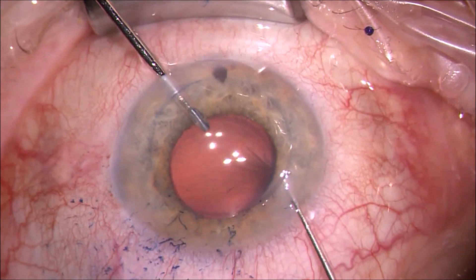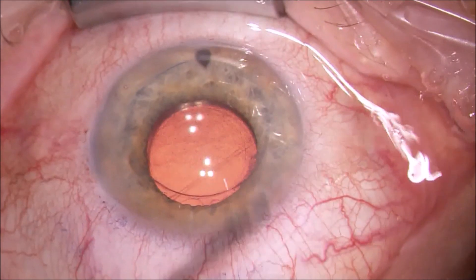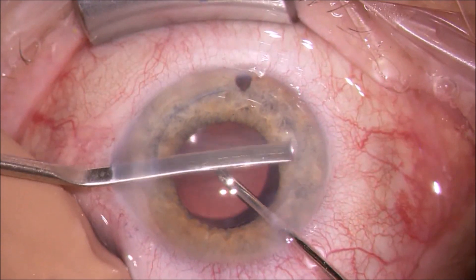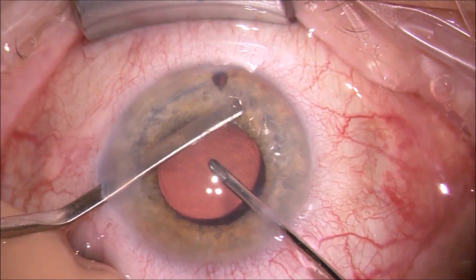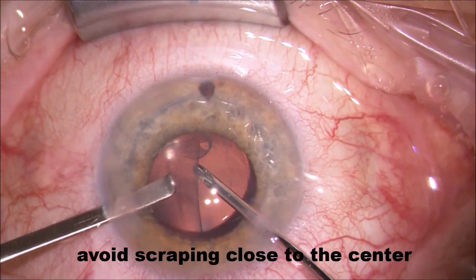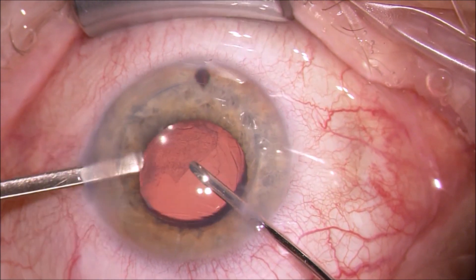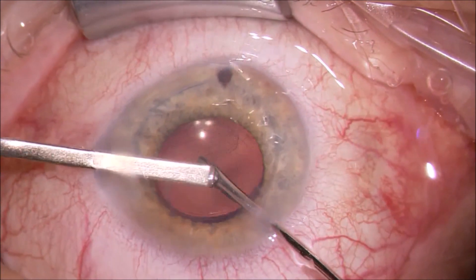This always depends on how many fluid remnants you have while preparing the DMEC. Sometimes you have to be a bit bigger in order to prevent an overlap. There are surgeons who do this under air, and from what I've seen in videos and heard from results, it works quite well. It's just my personal preference to do it under BSS solution. If you use the bigger scraper, make sure you are not scraping through the optical center — just have an indirect pull of the lamella within the optical axis and try not to scrape the stromal part within the optical center, as this can sometimes lead to optical problems.